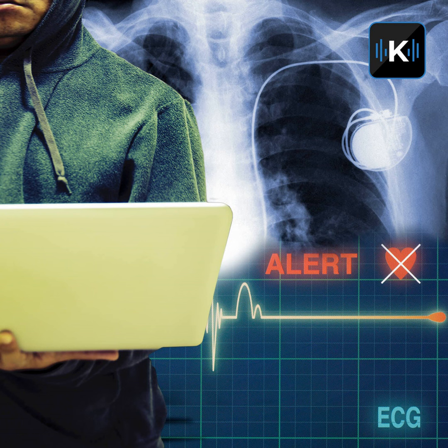One of the pacemaker programmers we're looking at, it's like literally a Windows XP machine, right? So you wouldn't know that unless you hacked it, but once you get access to the file system, you realize that's like a really old computer, basically.